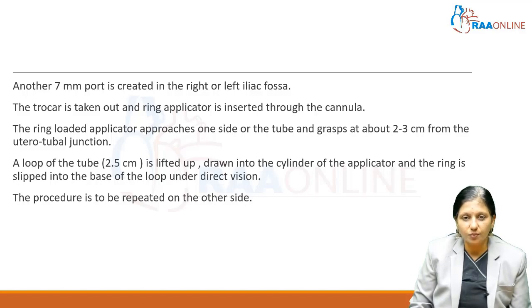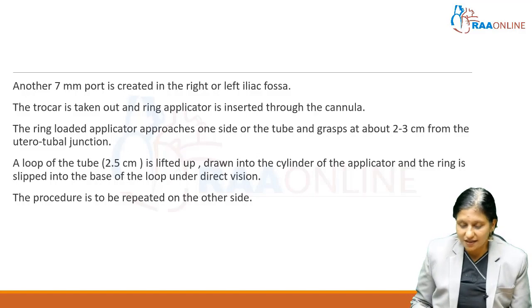The ring-loaded applicator approaches one side of the tube, grasps about 2 to 3 centimeters from the uterotubal junction, and a loop of tube of around 2.5 centimeters is lifted up, drawn into the cylinder of the applicator, and the ring is slipped onto the base of the loop under direct vision. We simply shoot and the ring applicator will slip it down the tube. The procedure is then repeated on the other side.